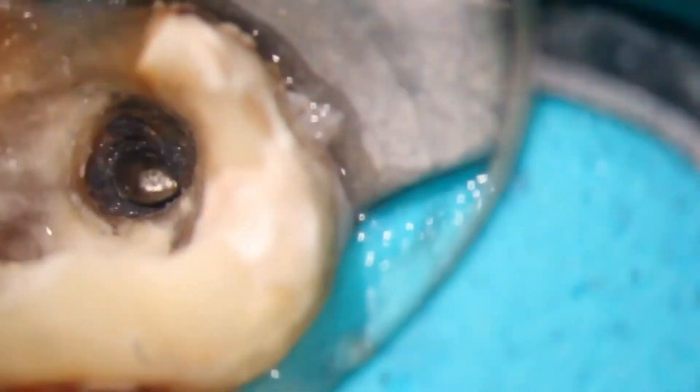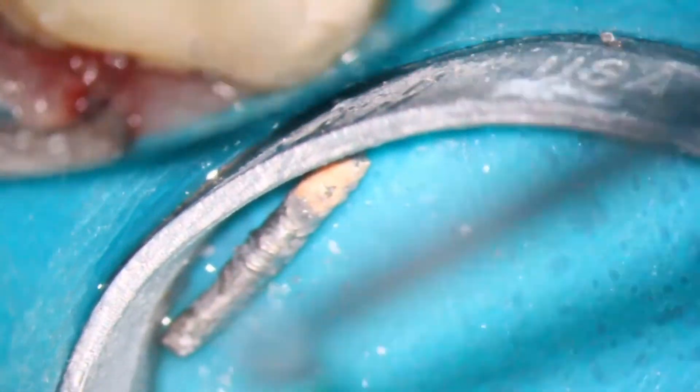We used ultrasonics to remove the post, so that we can clear up the infection.